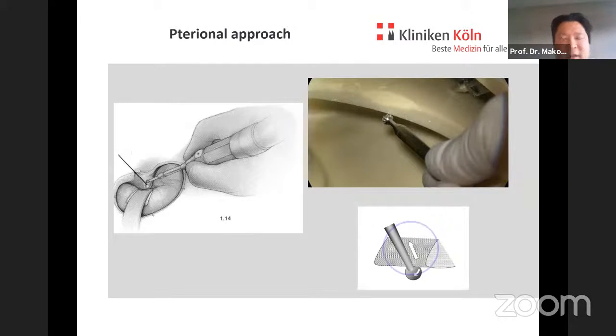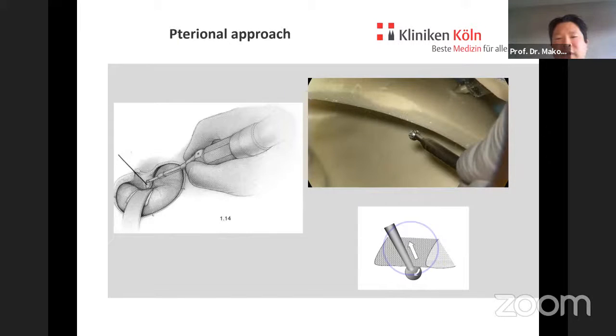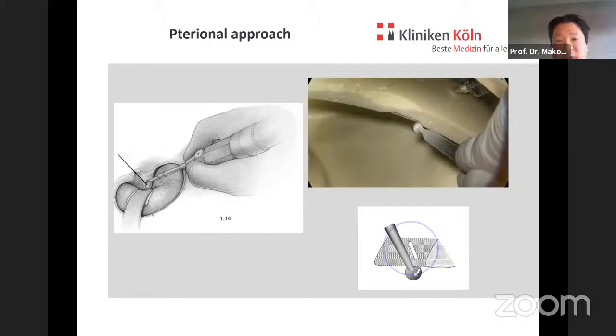Especially at the sphenoid wing, you get this situation: you've got a bony edge which is looking downwards, and you want to remove it, like in this situation here. And this is a nice situation for high speed drilling, of course, because you put the pressure to the bone, and you can handle it even when the wheeling effect should occur. So when you drill in this direction to the right side, and you're ablating the bone from down to up, then it is comfortably done, and the high speed drilling can be done very safely.